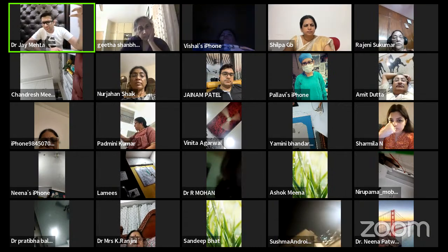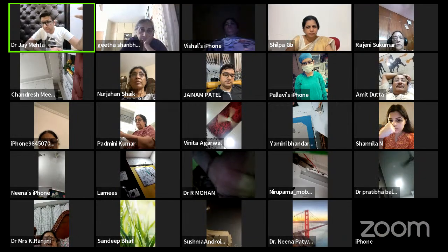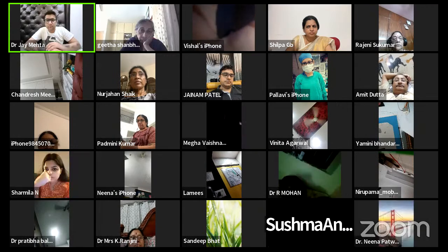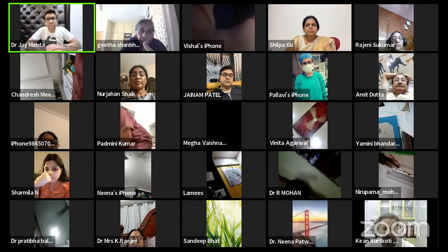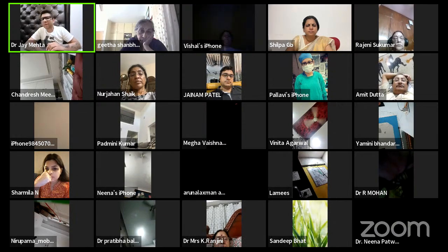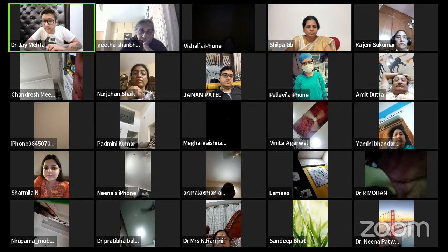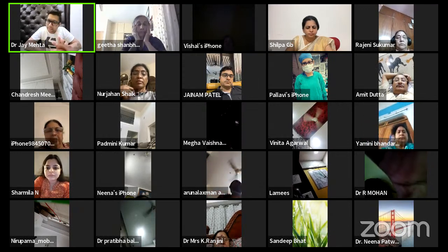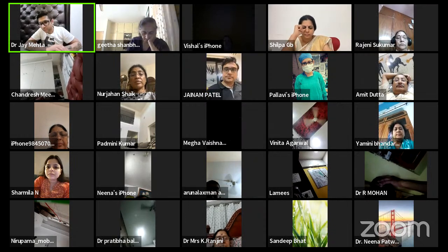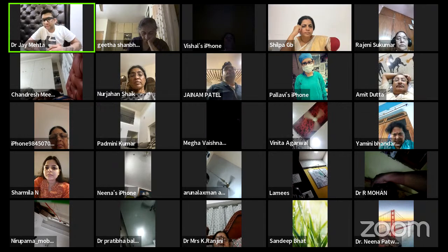You may diagnose and locate many things. You may find a small polyp. In that situation, there is no point running out and taking further signatures of the patient and doing all those things. Simplest options are really simple options. Take consent for operative scopies simultaneously when you do your diagnostics. And when you take a simultaneous consent, you will end up treating most of the procedures which you see on a diagnostic hysteroscopy. Right?